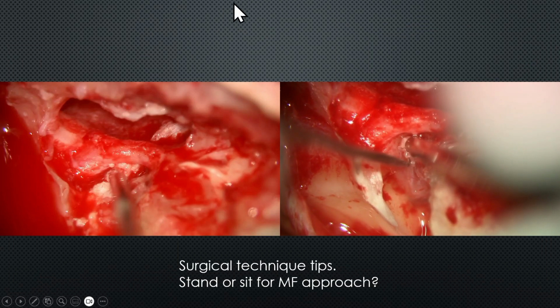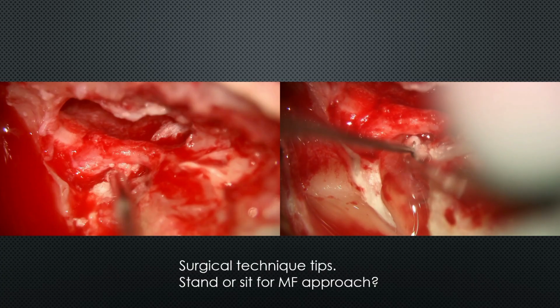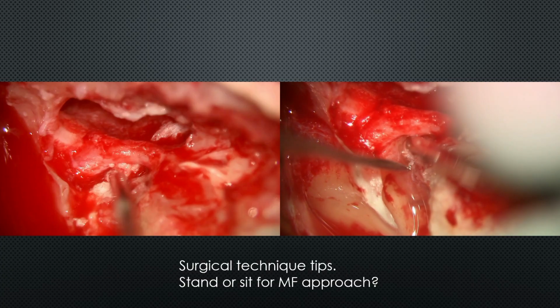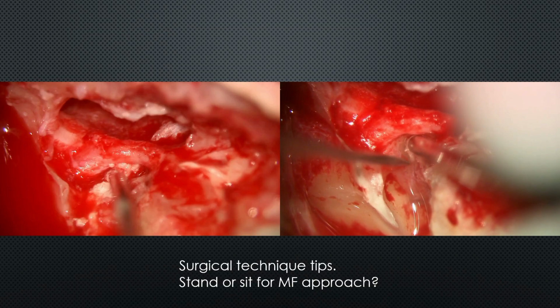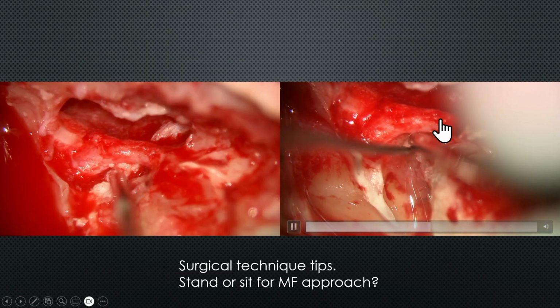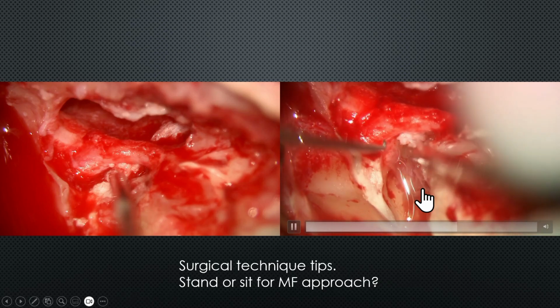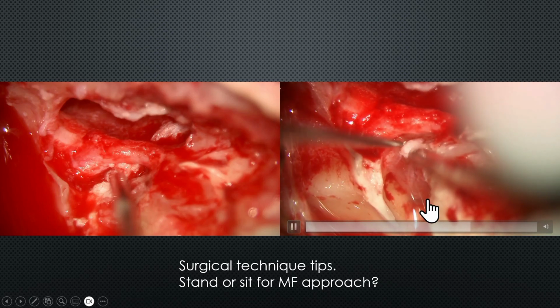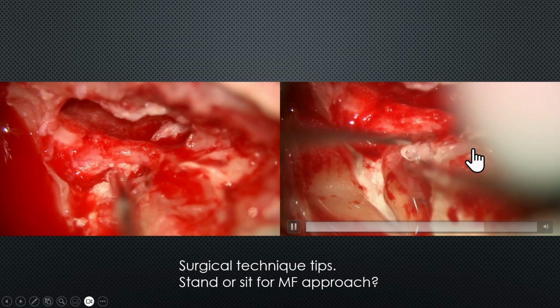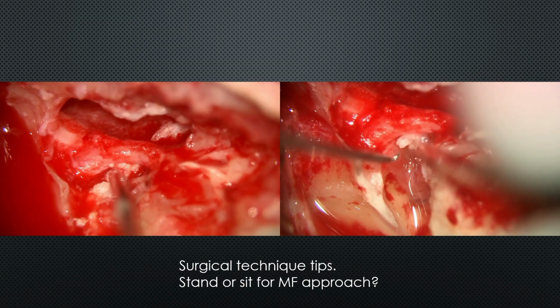And this was, I'll just run a couple of images here. The one that's running right now is actually the very end of taking out the last bit of epithelium, I hope. And then I'll run the other one in a minute too. But this is the horizontal portion of the facial nerve, geniculate, labyrinthine segment, and then the distal IAC is here. By this point, most of the labyrinth has been drilled away and is filled with bone wax.